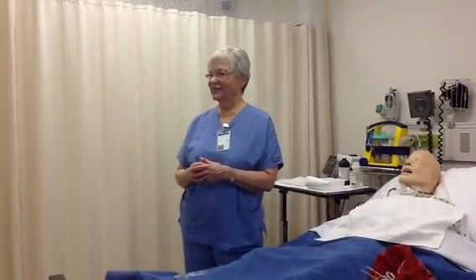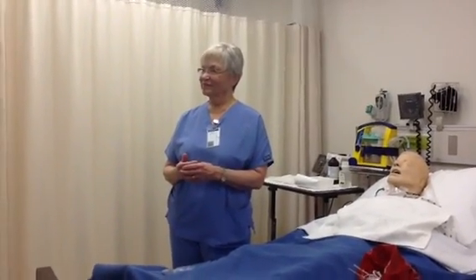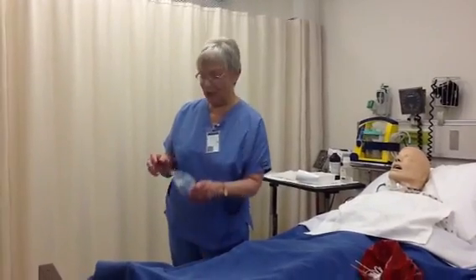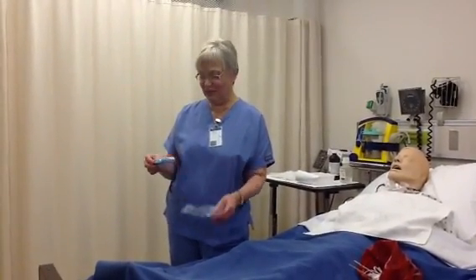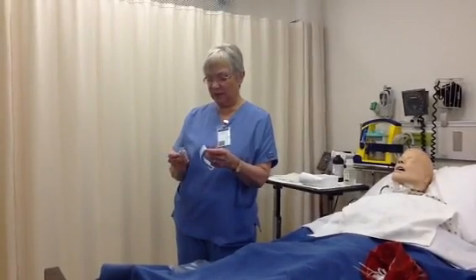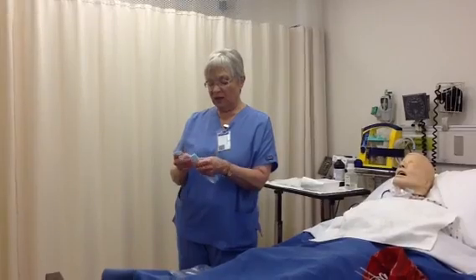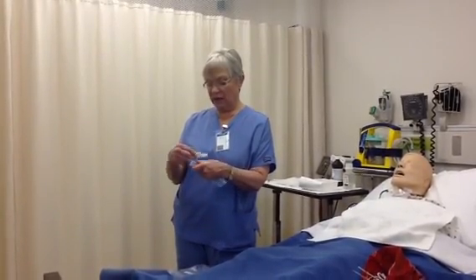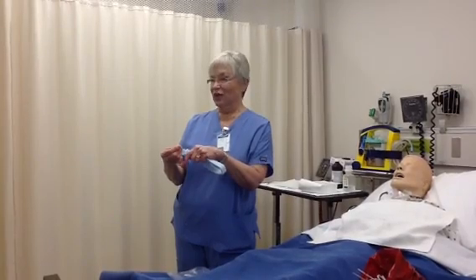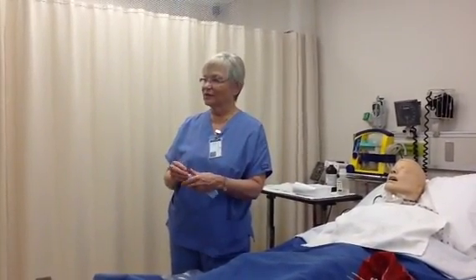Yes, I have one about the trach care. Do you always use tape trach ties, or is there another device you can use? I'm so glad you asked that question because I do happen to have one here to demonstrate. Many times there are many different types of ties. This one happens to be a Velcro one, and many of them are Velcro. So this would be the adjusting part of it right here, and then this would Velcro and come around through the openings on the trach, on the flange on the trach. So yes, good question, thank you.